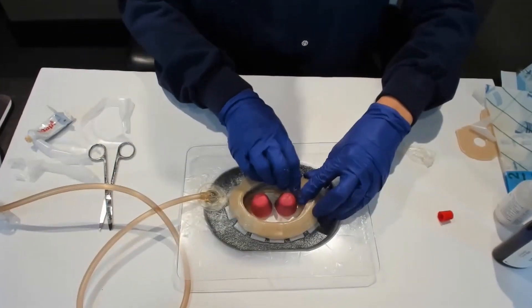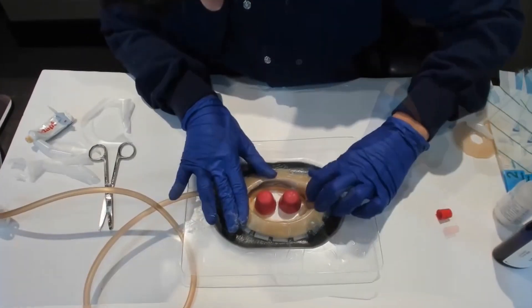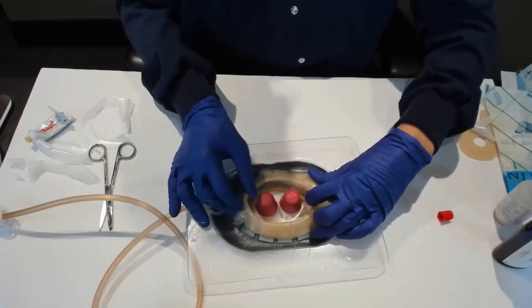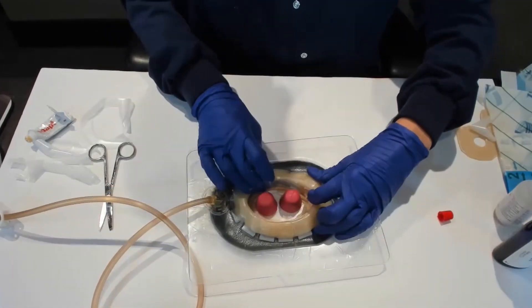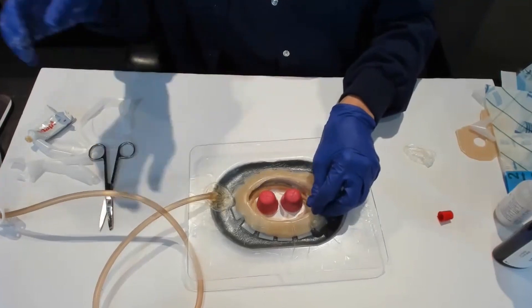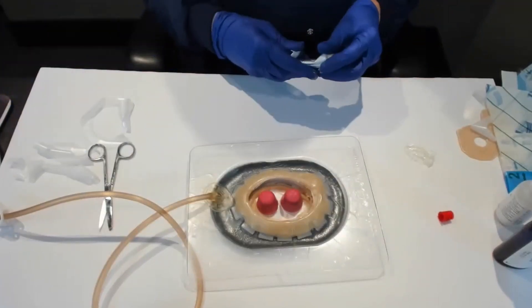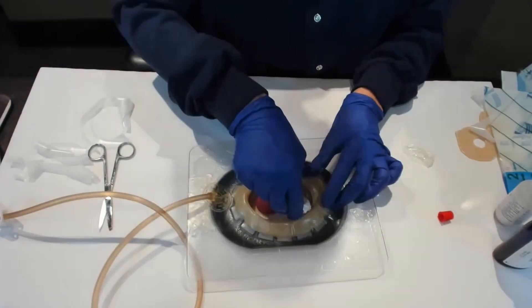Now is when you're like, where is that little leak? I know it's here somewhere. Oh yeah, it's always this junction, isn't it? Almost always.